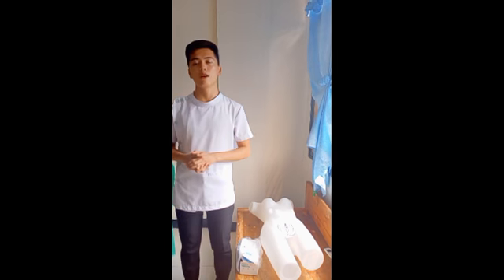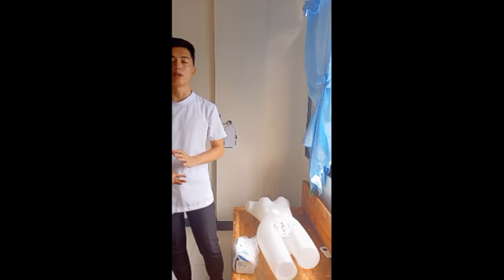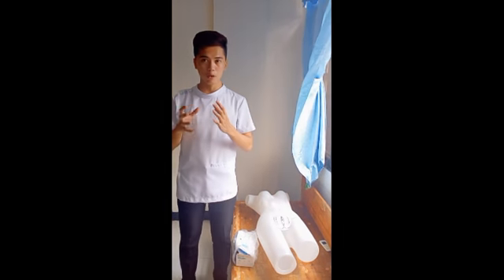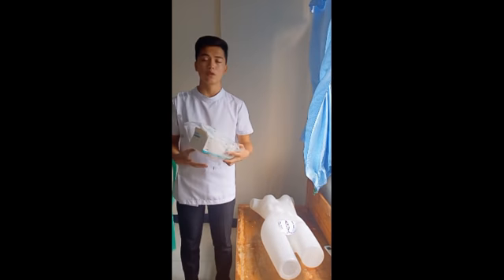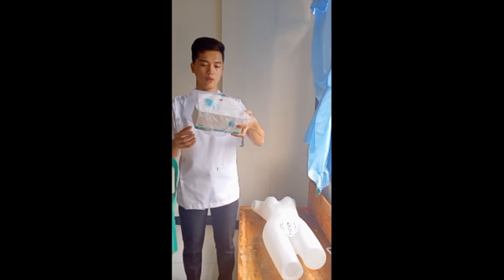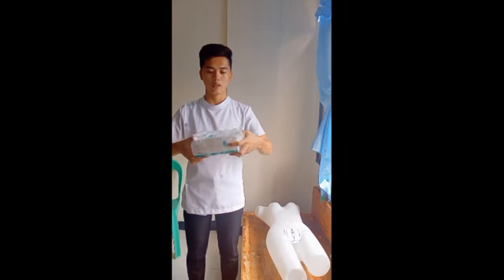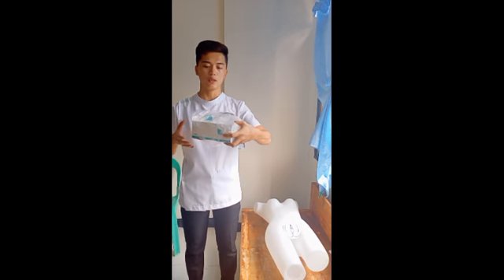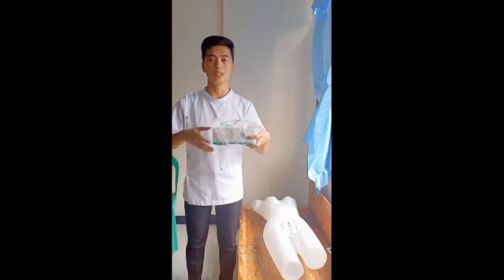If you are right-handed, you need to position yourself on the right side of the client. If you are left-handed, you need to position yourself on the left side of the patient. The next is I'm going to open the catheterization kit. This is the catheterization kit. If you can see, this is sealed and cannot be used, so we need to open this because all the equipment inside is what we need in this procedure.